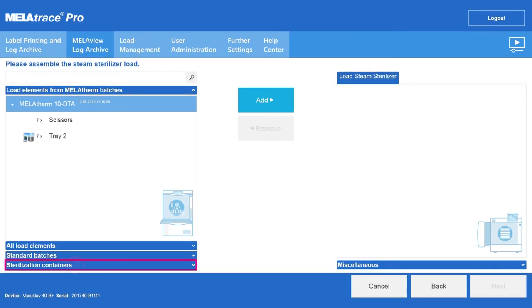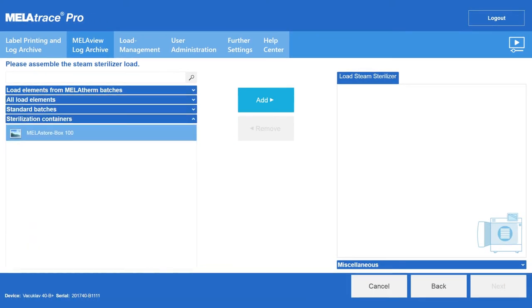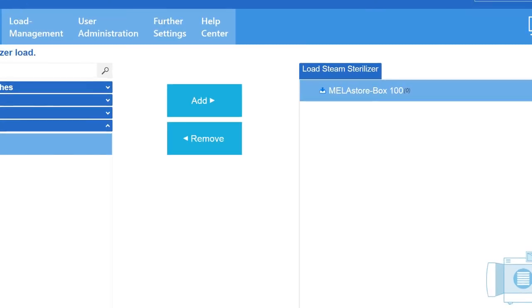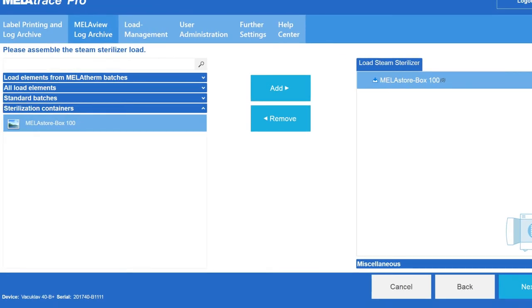To do so, click on the sterilization container tab and add the MELAstore-Box to the steam sterilizer load. The symbol in front of the MELAstore-Box underscores that you can start loading the sterilization container.